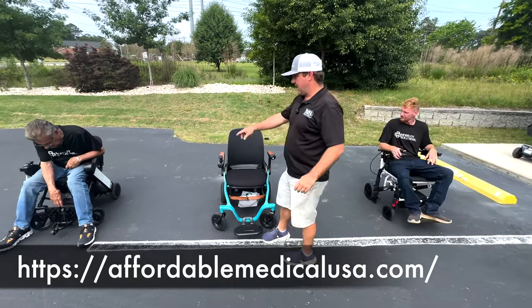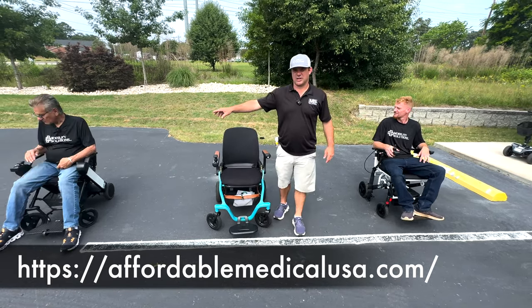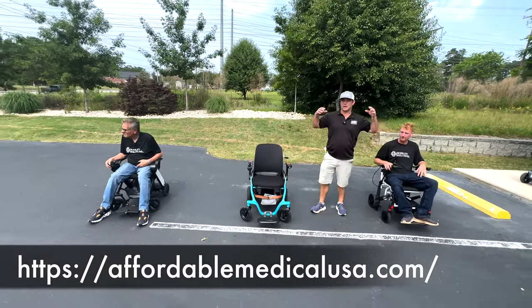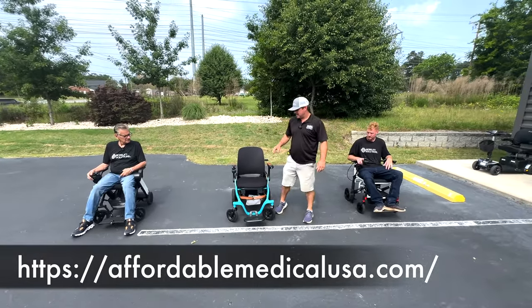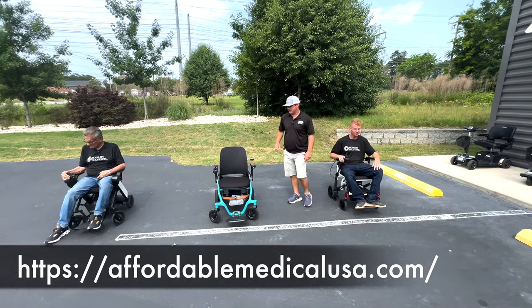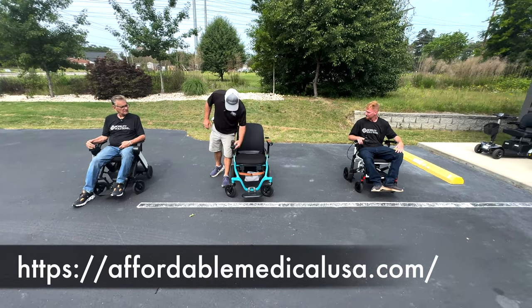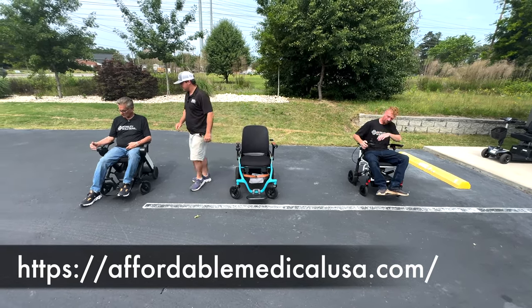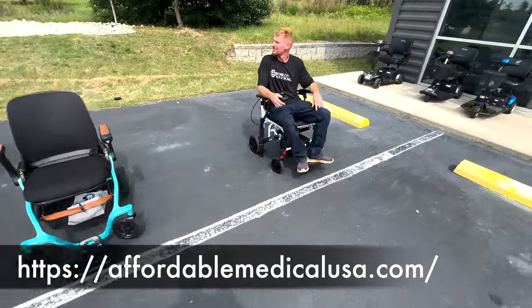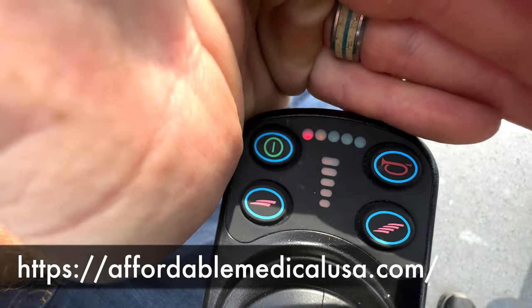Again, digital dash, voice. That one also talks to you if there's something wrong with it. Both of those have Bluetooth. This is just your standard. The sun's on us, a little bit of an overcast. This one's harder to see what speed you're at. This one's reasonable. This one's the clearest. So if you have a little bit of vision trouble, you're probably gonna like the F5 better.